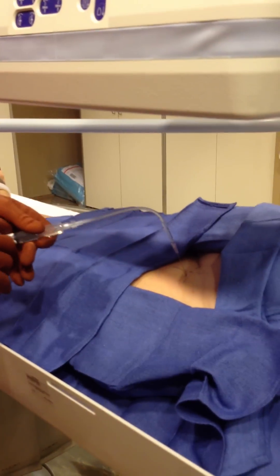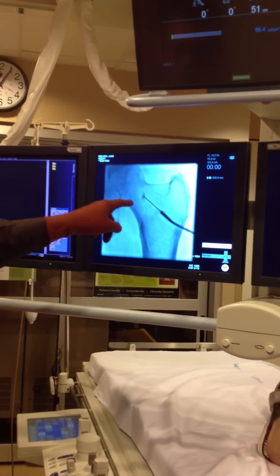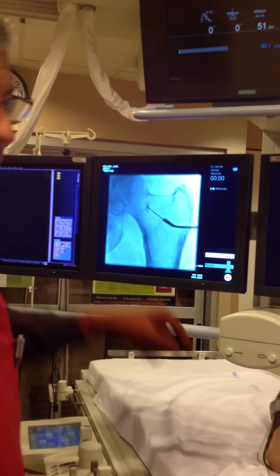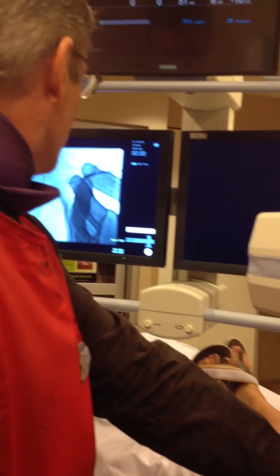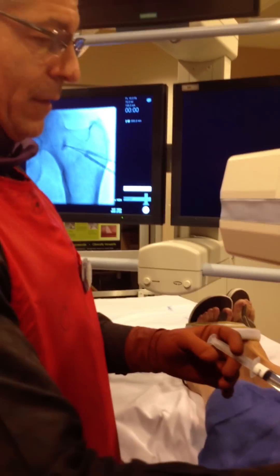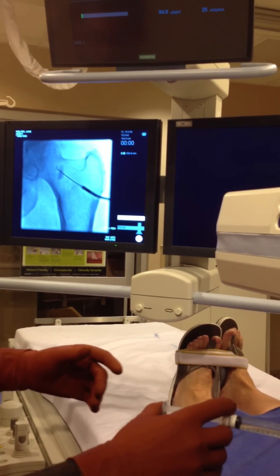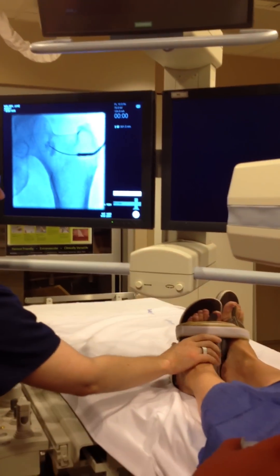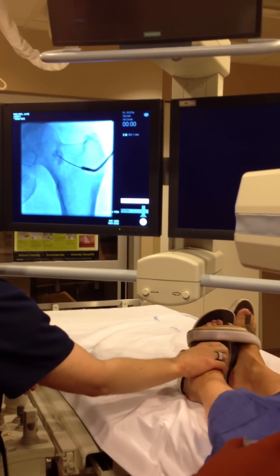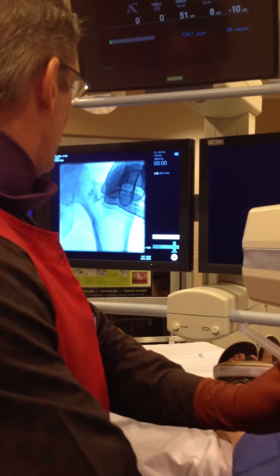We're going to inject — back to the fluoro screen. This is Isovue 300, connected to extension tubing. We're going to inject a little bit. If it pools at the needle tip, you're not in the joint — you have to back the needle off and find another position. Sometimes this takes one time, sometimes you might have to do it a dozen times. You have to get the contrast flowing away from the needle tip to prove you're in the joint. That still looks like it's pooling, so we're going to back it off again and find another spot on the femoral neck.